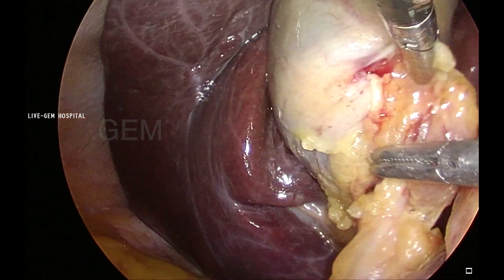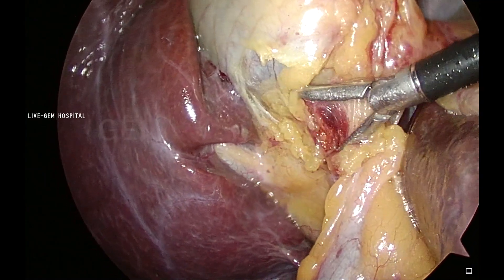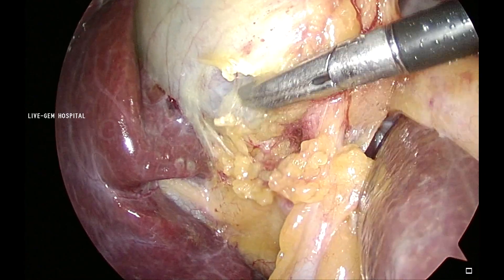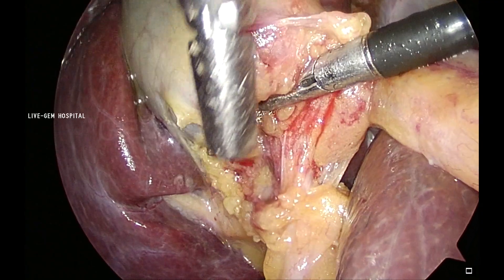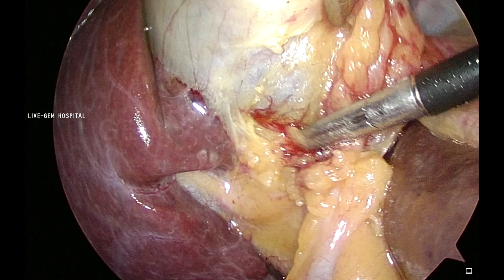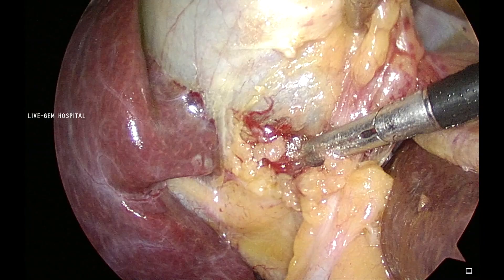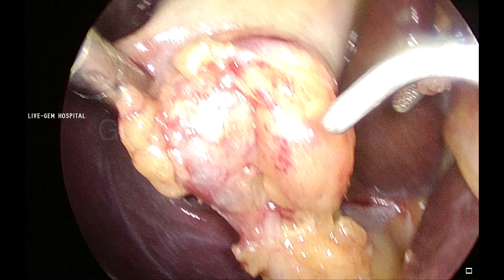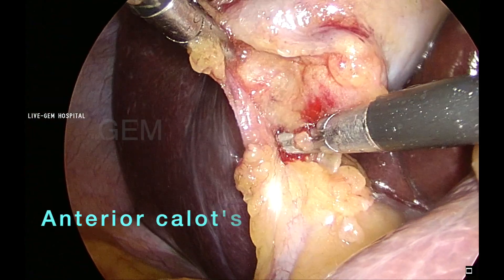I am holding the infundibulum and retracting it upwards and medially so that the posterior Calot's is being exposed, with some fat dissecting. Just keep the instrument open a little bit and then coagulate the fat or small vessels. Some patients may have a posterior branch of the cystic artery — you should not injure that. Traction is the key factor — I am applying cautery but you cannot see any black spot. If the traction is less, more cautery energy will go into that area, producing carbonization with maximum temperature in that particular area.